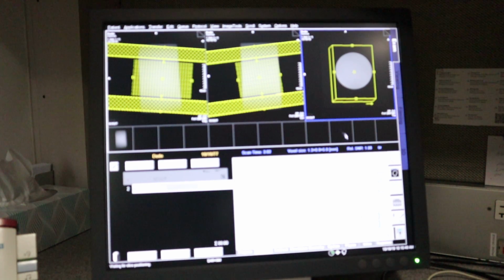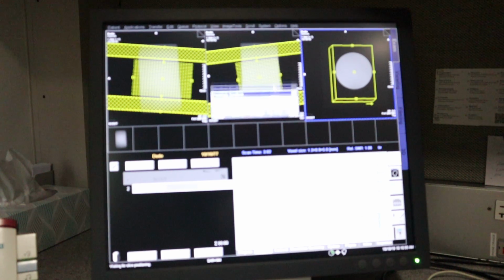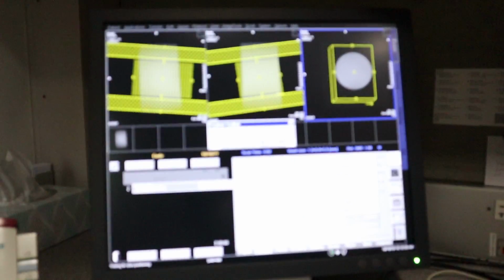But we're going to click on Brett Michaels over here, the guy with the bandana, the three pink lines. We're going to click on that. And that's going to open up the position toolbar. Now, I'm not going to go over all this stuff. We don't really need to know all that. But what we're looking for is right here in the bottom right-hand corner. And if you hover, it'll say adjust volume on and off. So if we click on adjust volume on or off, we're going to close our position toolbar.